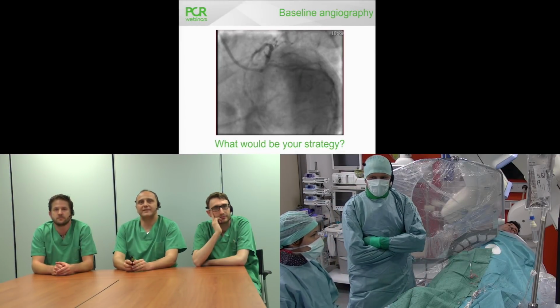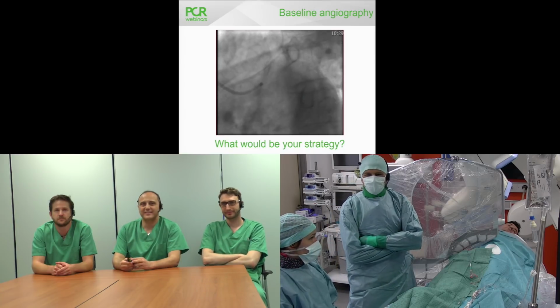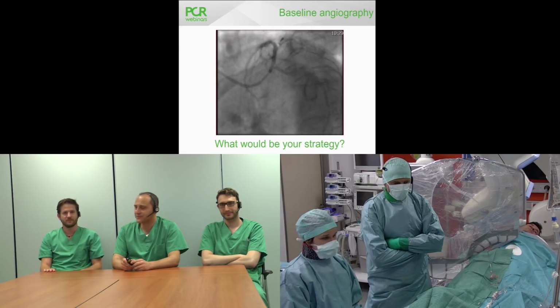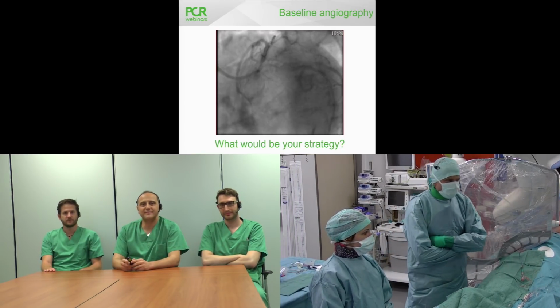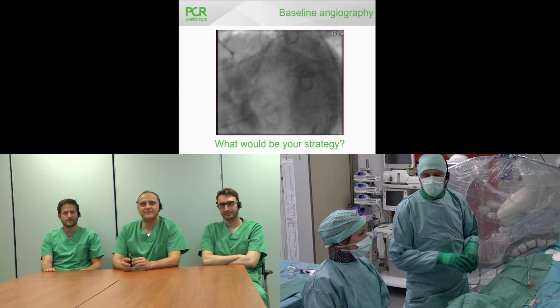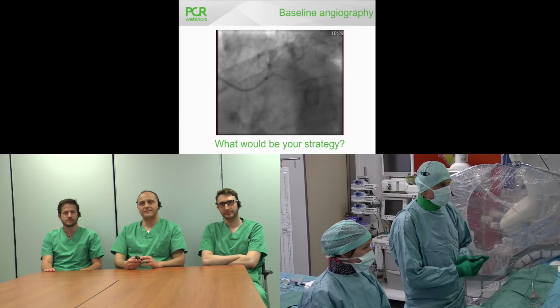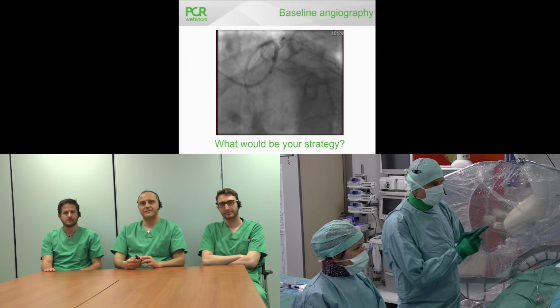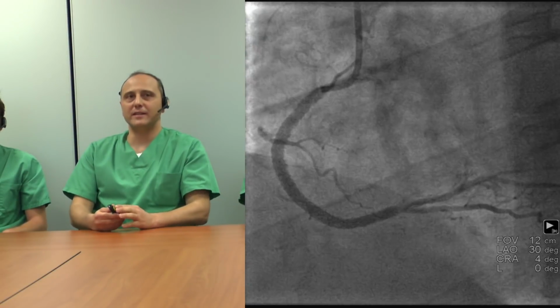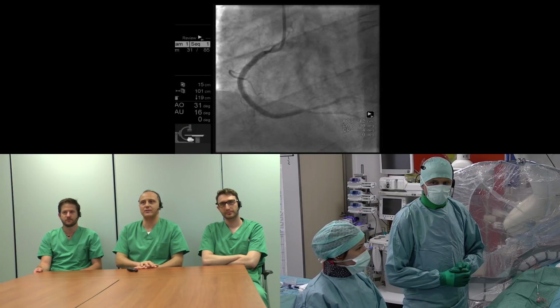Hello, Emanuele. Yes, welcome to the Cat Lab. Thank you, Emanuele, and thank you, Gabor, for joining us. I'm working here with Katja and Eddie, and we were listening to you, and what we did in the meantime is to repeat the shots like we always do. We first checked the right coronary artery. Maybe you can show that there. Yeah, perhaps, Bernard, give us a minute. We will join you there, so you take over and you walk us through your angios.